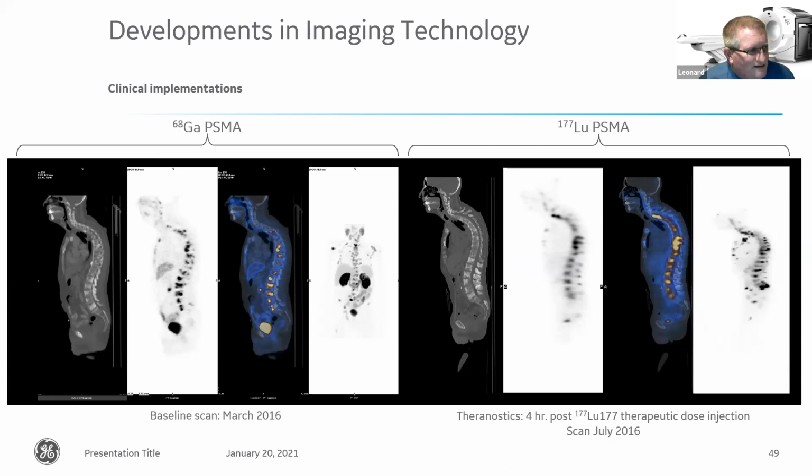These are metastatic sites caused by the prostate cancer within this patient. When they did the imaging follow-up, they decided they could treat this with lutetium given to the patient, which will be taken up by the tumor sites. And because of the cadmium zinc telluride, we can then image that uptake within the patient and see the response of all these metastatic lesions.